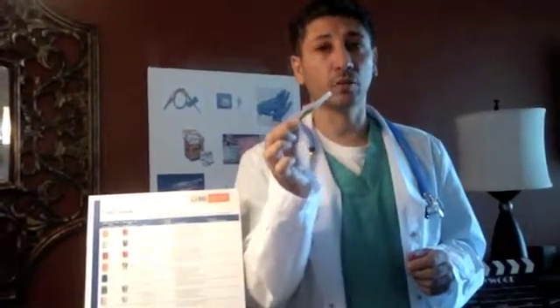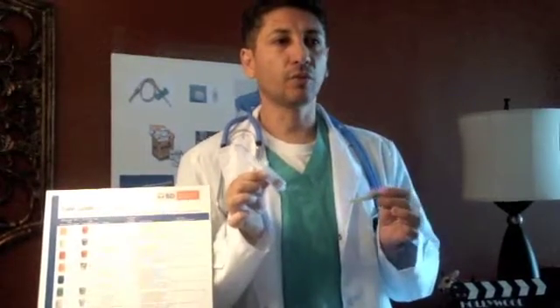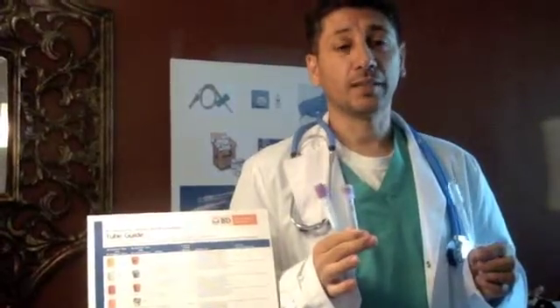The vein is punctured with a double-ended hypodermic needle. Its inner part is protected for safety by the holder. When the test tube is pushed down into the holder, the rubber cap is pierced by the inner needle, and the pressure difference between the blood volume and the vacuum in the tube forces the blood through the needle and into the tube. The filled tube is then removed and another can be inserted and filled in the same way. The plastic caps are opaque for tubes with a normal vacuum. Translucent top tubes contain a weaker vacuum in the same sized tubes and will obtain less blood for smaller sized veins.